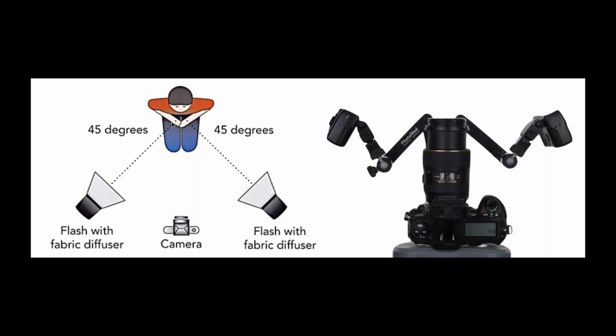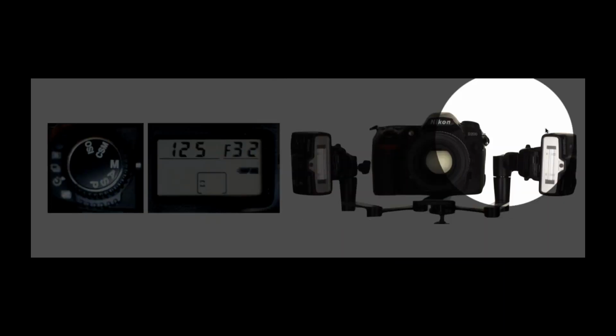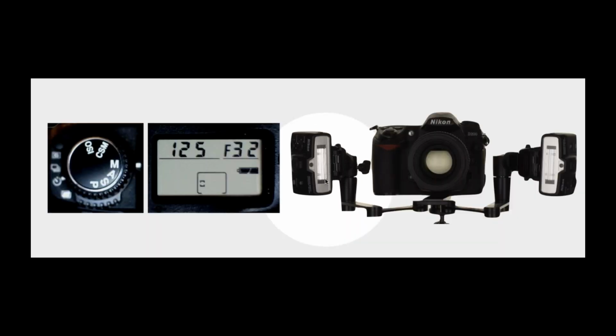And I have the ability to adjust those flashes for more power or less power separately from what's happening inside the camera. That's why the settings are one aspect, and then the flash settings are a second aspect to it. So again, 125, f32, but then I'm going to power up my flashes. And I may increase the output or decrease the output of my flashes to compensate for these numbers.